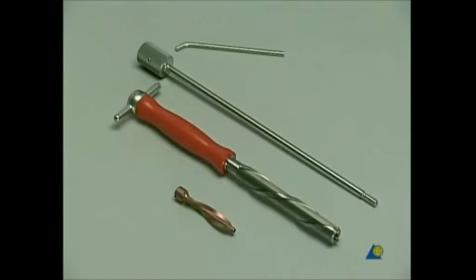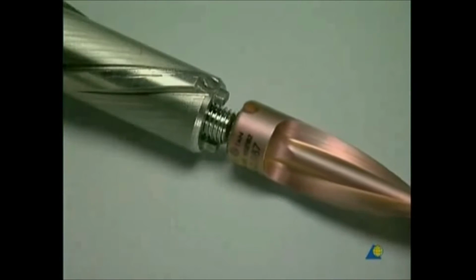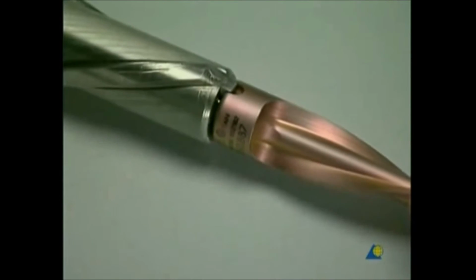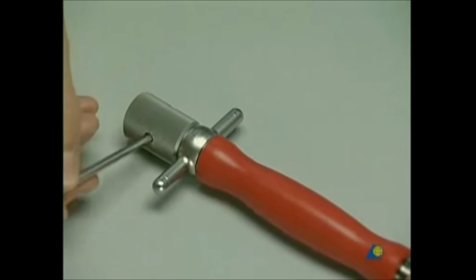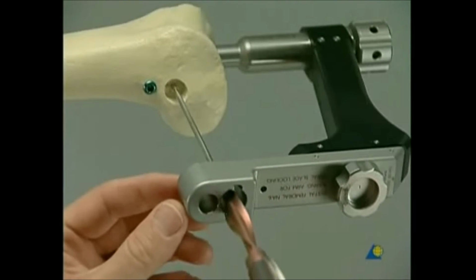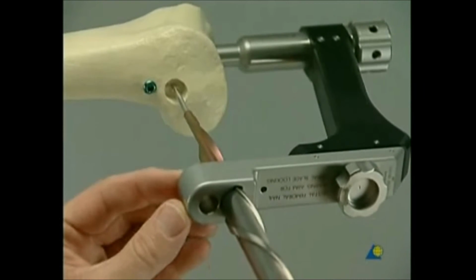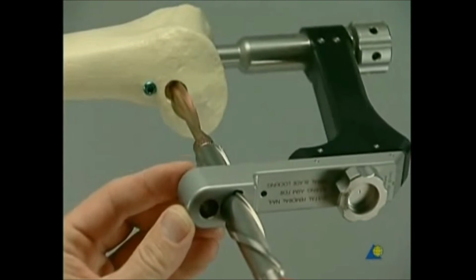The spiral blade is mounted onto the spiral inserter by first sliding the connecting screw into the inserter, then placing the spiral blade over the teeth of the spiral inserter and tightening the connecting screw using the pin wrench. The spiral blade is advanced over the guide wire onto the bone with the spiral inserter placed in the notches of the aiming arm.